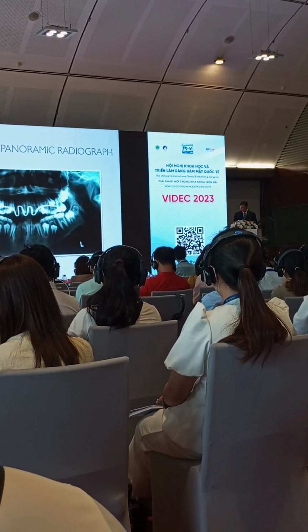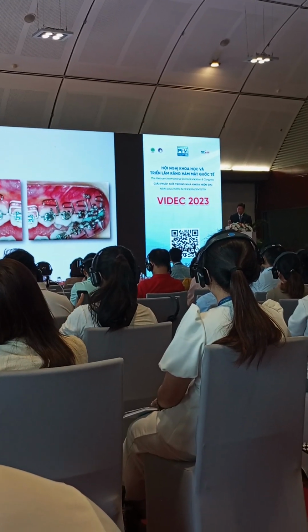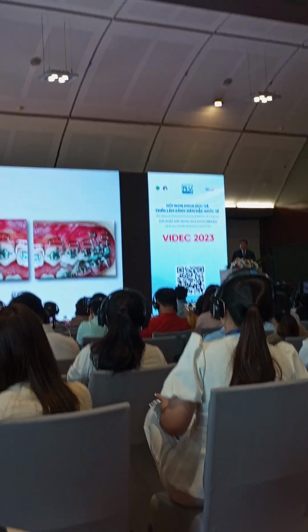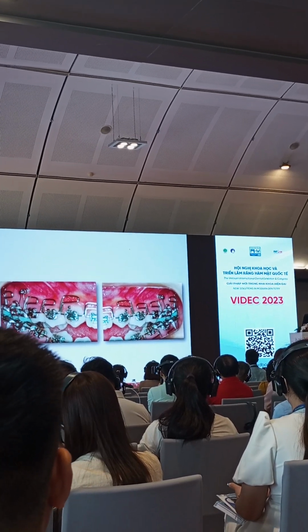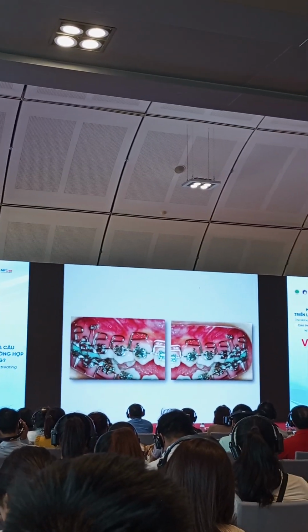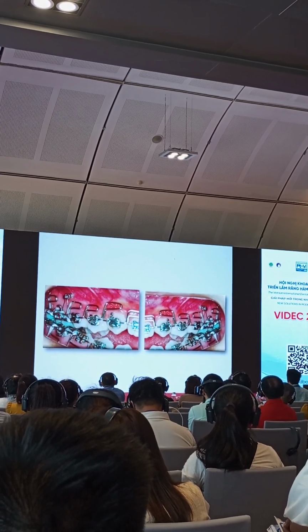So when the patient came, I installed the mini implant on the posterior area because I wanted to intrude. Because this is my first mini implant case, I'm so scared of placing implants on the palatal area because of many blood vessels and nerves on the posterior area that I'm still a little bit hesitant to place it.